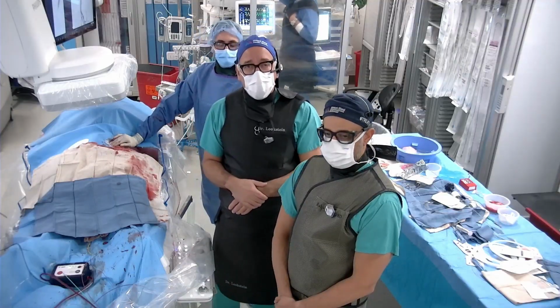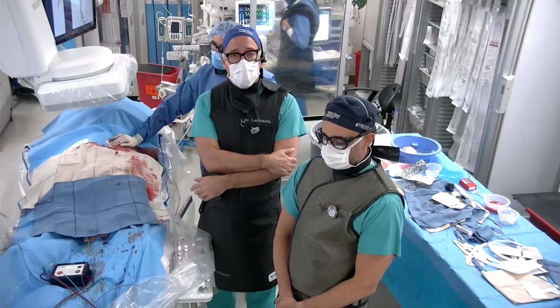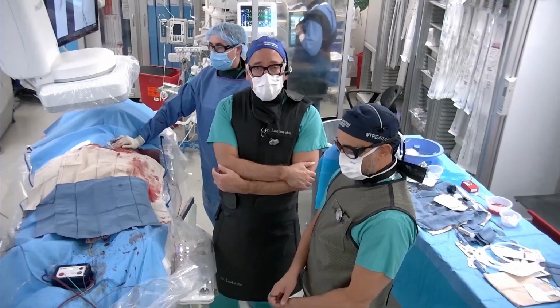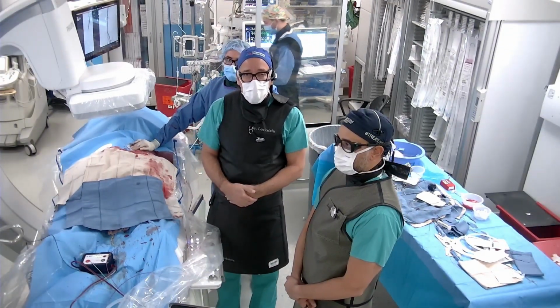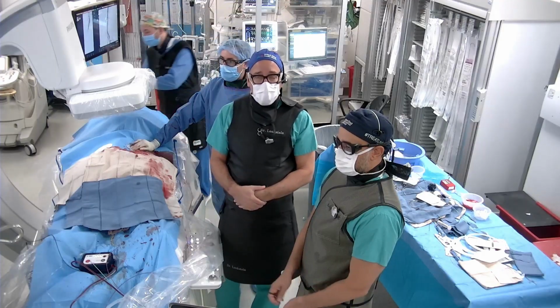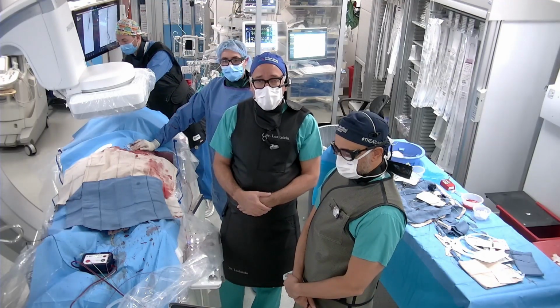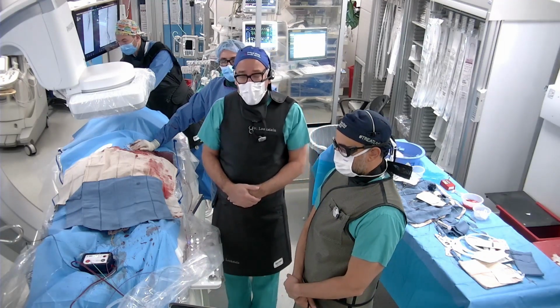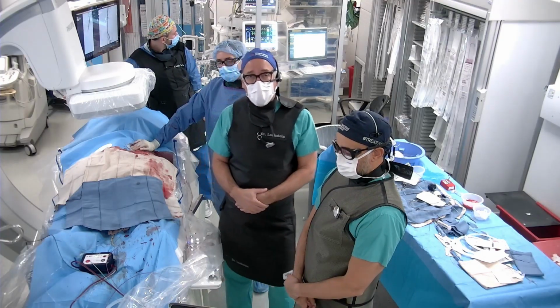Hi, everybody. So we just finished. We wanted to give you an update on what we ended up doing. The panel was incredibly helpful in giving us insight. So to make this very succinct, we did take a 6 French Bolt catheter from Penumbra down to the popliteal trifurcation, and we ran it through the popliteal artery and the tibial peroneal trunk. We were able to aspirate solid material and restore flow to both the posterior tibial artery and the peroneal artery.